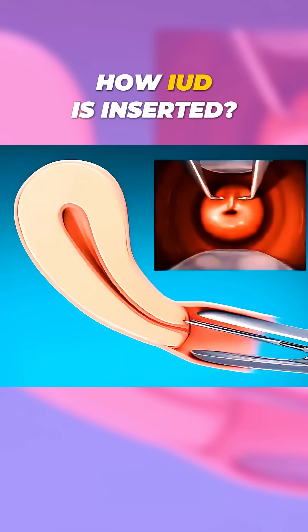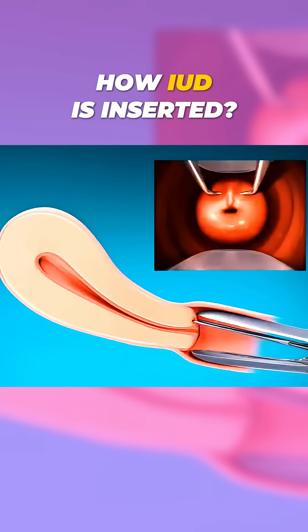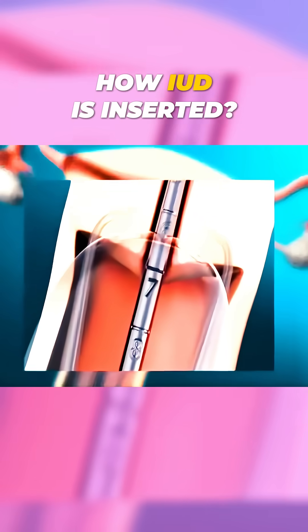Then, they use a speculum to get a clear view of the cervix and clean the area with an antiseptic. Next, the cervix is stabilized with a special tool, and the depth of the uterus is measured to ensure the IUD fits correctly.